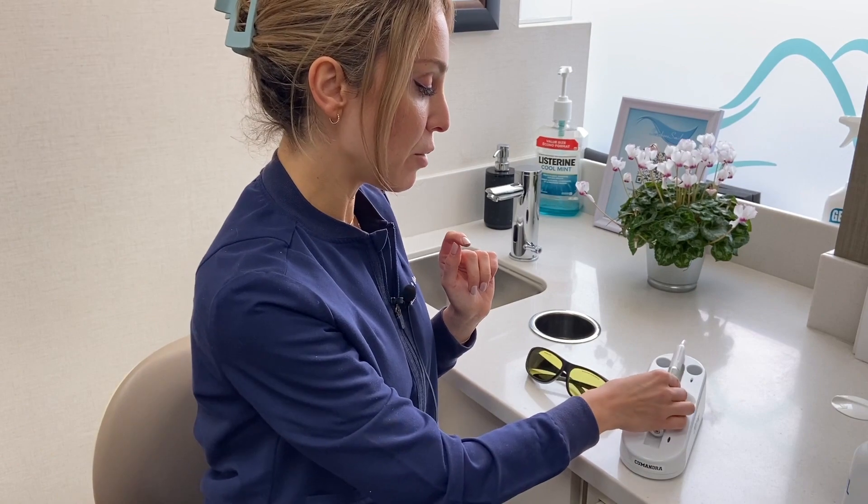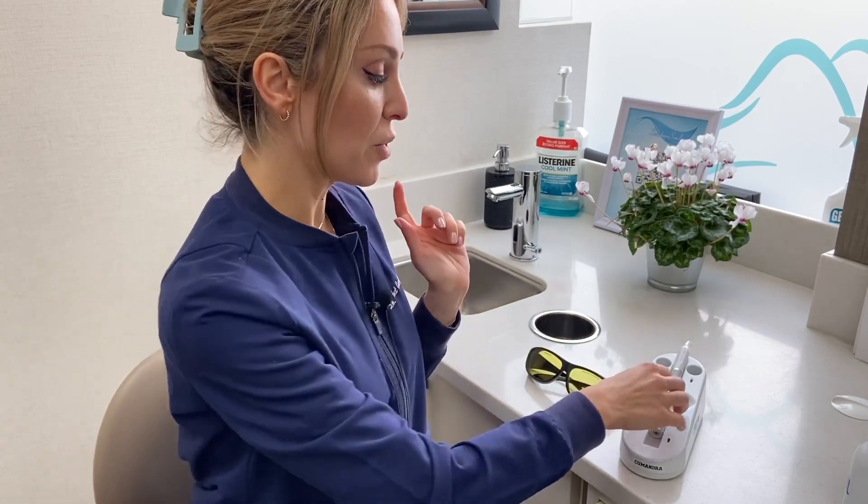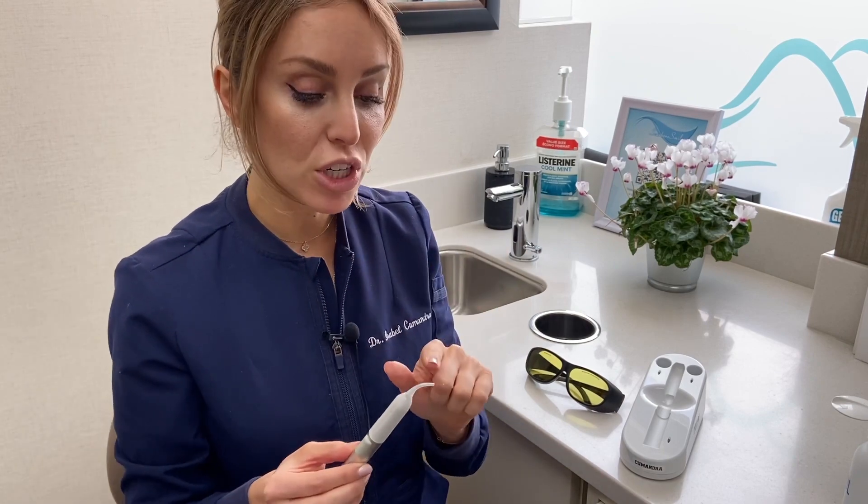So we tested the tip, it's ready to go, it's lit up. The one really important thing to know — there is actually zero pain or soreness or sensitivity with this procedure. You don't need any freezing, you don't need numbing cream, nothing. Because with the tip of the laser, we don't actually touch the cold sore. There's nothing that actually touches or burns. We're just using the light. The light is going to be shining on the cold sore from about two millimeters away, and that's what stimulates the healing. So very little sensation at all — sometimes it actually just feels a bit warm.